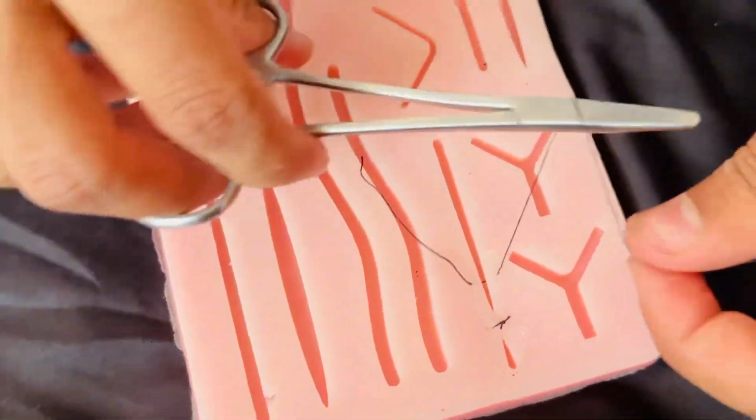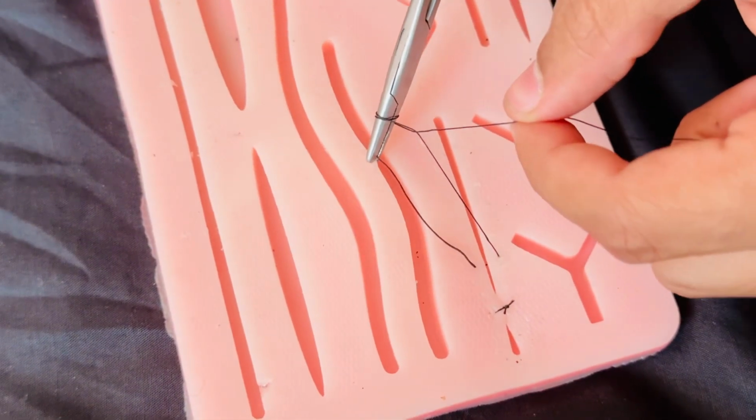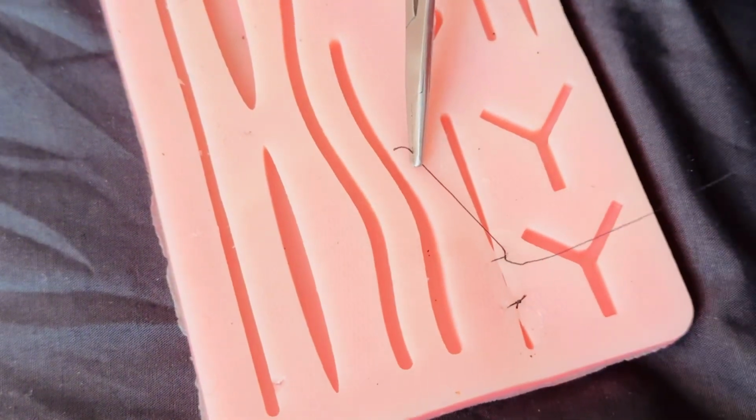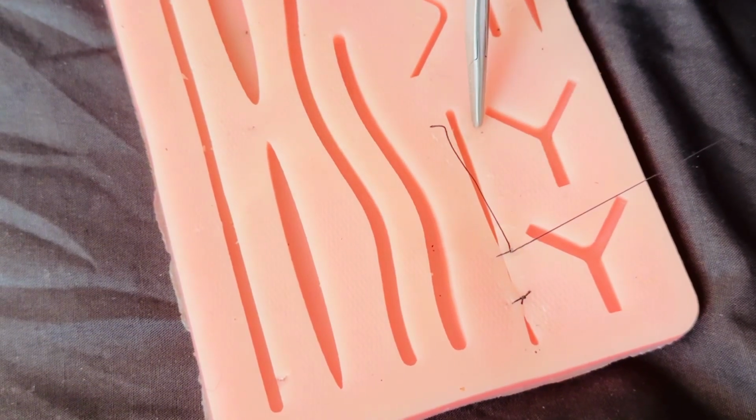Take out all the thread, leaving behind a little bit at the end, and give again the same type of knots as previously, and you must maintain the inter-suture distance in order to have a beautiful outlook.